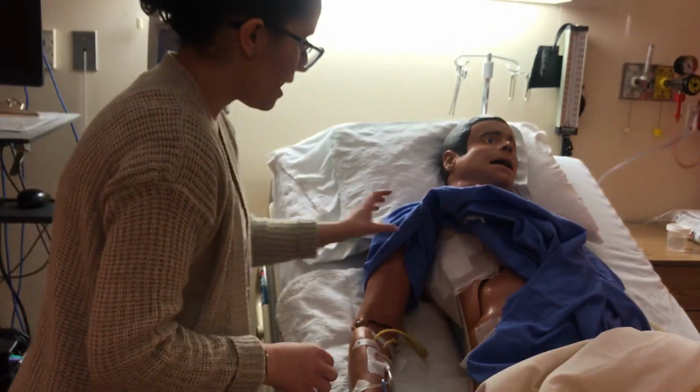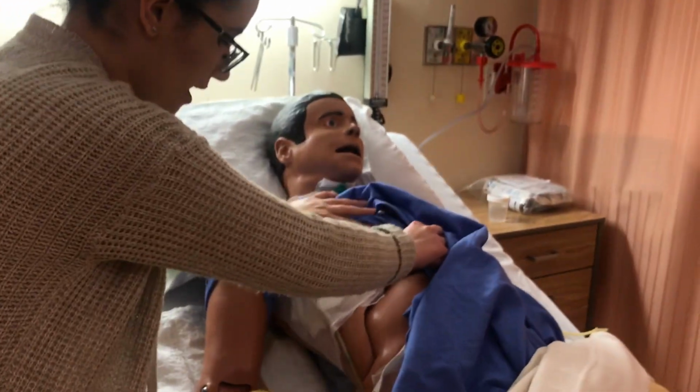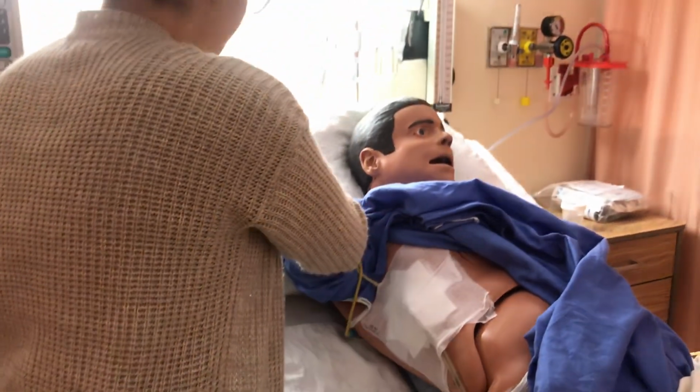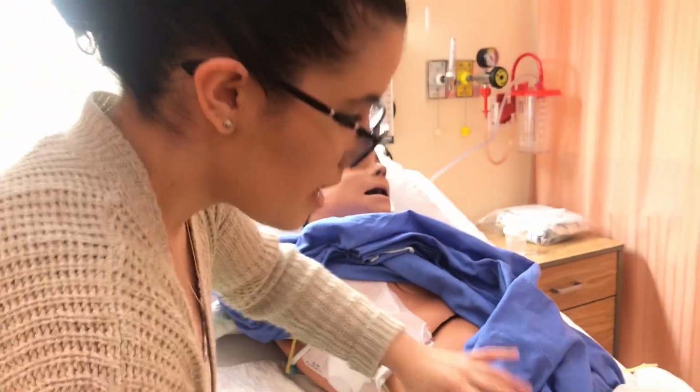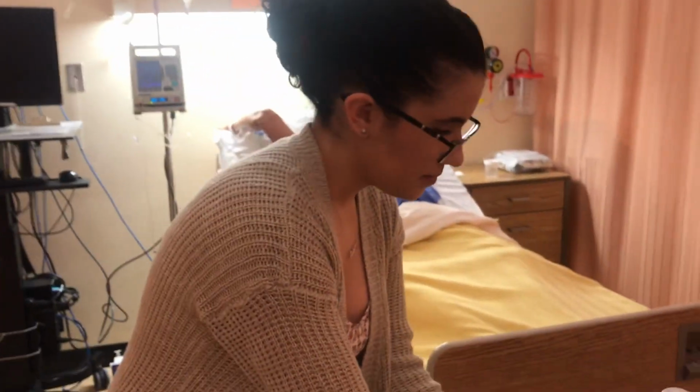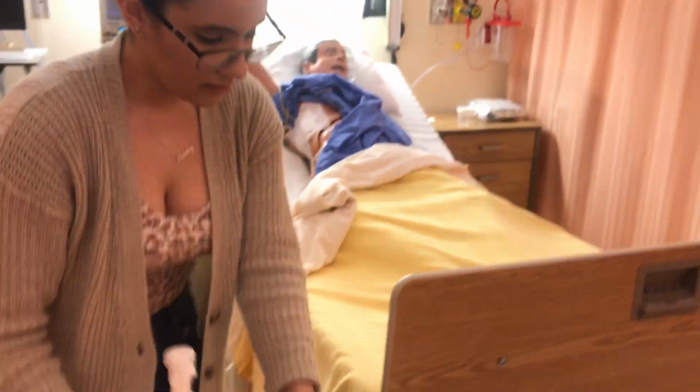So Wendy, I'm going to go ahead and start with your dressing change now. I'm just going to ask her to lift her arm as far back as she can go, and the patient would have them on their side as well. So then I'm just going to get my supplies going here.